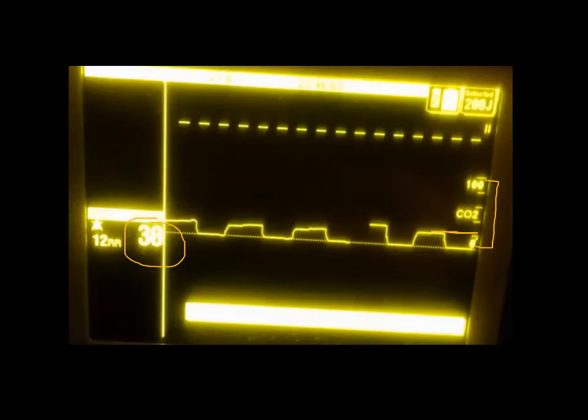And you'll notice that it's smaller boxes, which is not a big deal. The number is the same. The shape of the boxes, although smaller, are the same. But if you would just glance at those small boxes, you might think that the patient is breathing really fast. Without looking at the number, you might say, "Oh, they're breathing really fast and they're hyperventilating." But look at the number and look at your scale.